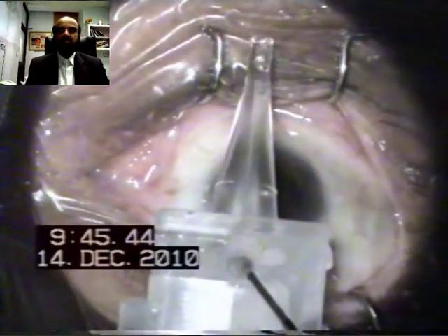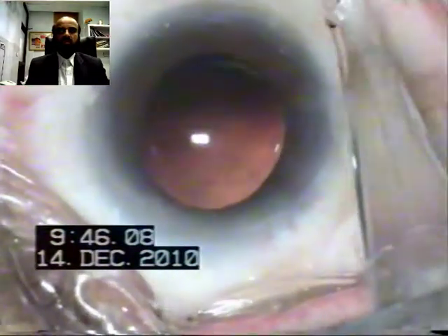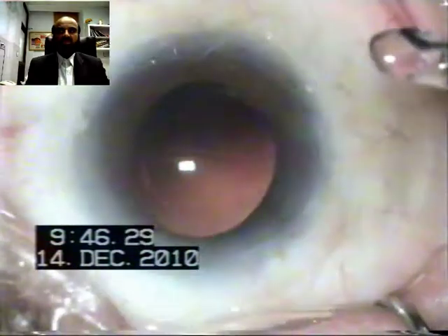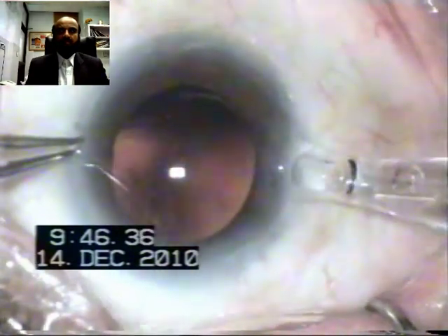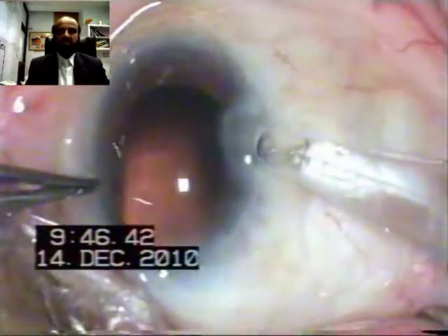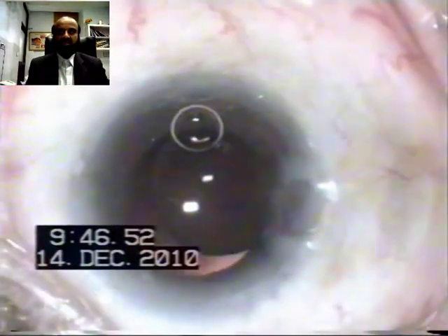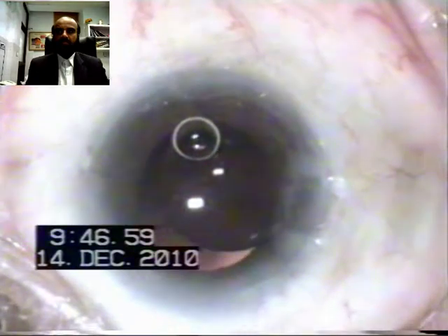The system is turned upside down, viscoelastic is injected into the nozzle through the little hole, and the system is ready. The IOL moves inside the nozzle, but here there is no sleeve — the plastic V-shaped plunger is pushing the IOL haptic in front of it. The eye is stabilized. The nozzle is a little bigger than our 2.75 millimeter incision, so we simply inject it on the lip and do not go inside the anterior chamber.